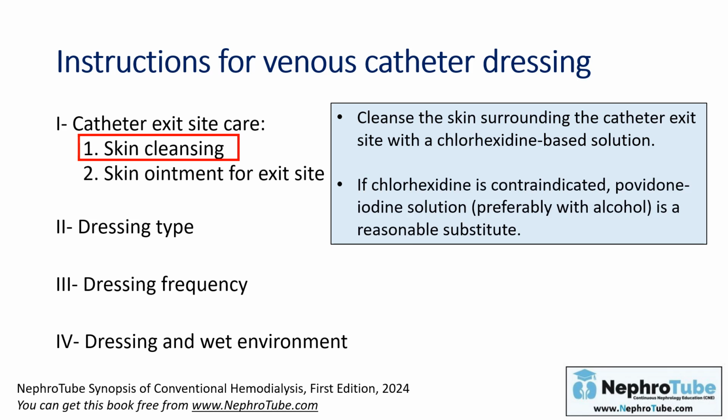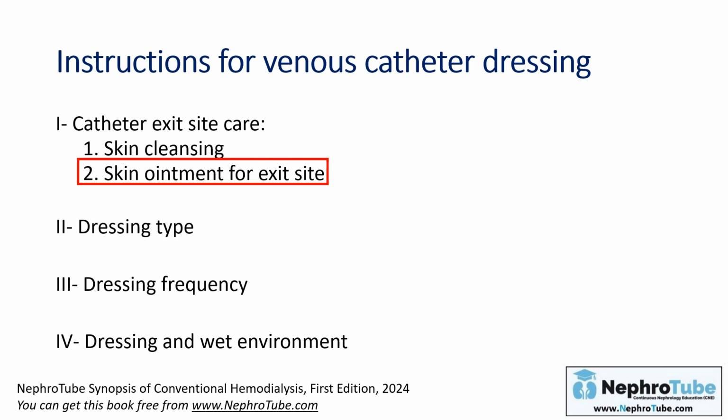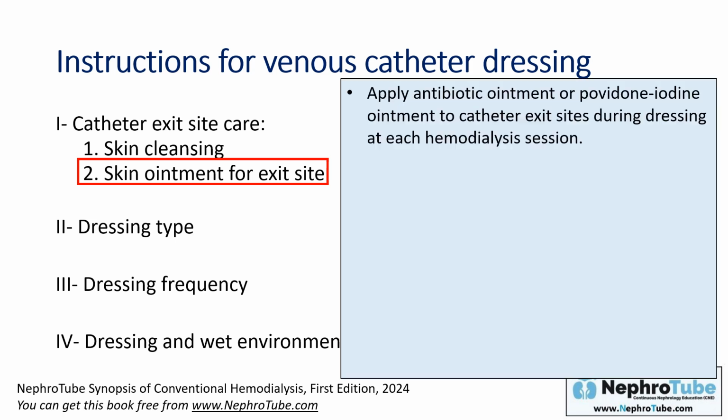Can I use skin ointment for exit site? Actually, applying antibiotic ointment or povidone ointment to catheter exit site at the end of hemodialysis session is recommended. And you will find a lot of examples for antibiotic ointments that can be used.